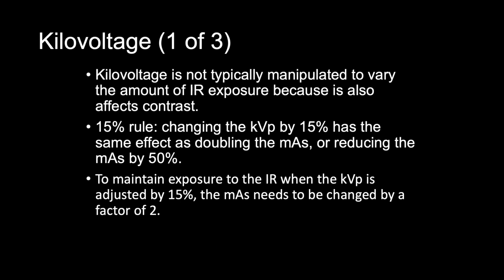Assuming that the anatomic part is adequately penetrated, changing the kVp does not affect the brightness of the digital image. Image brightness is going to be controlled by the computer processing. Kilovoltage is not typically manipulated to vary the amount of IR exposure because it also affects contrast.